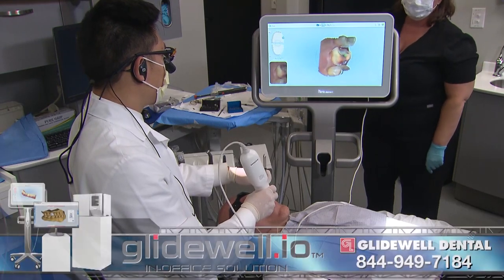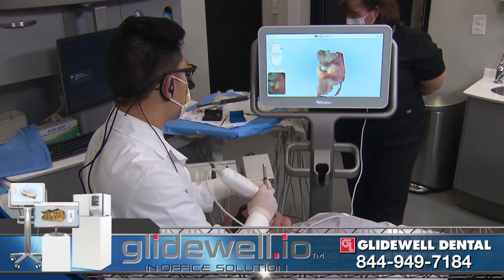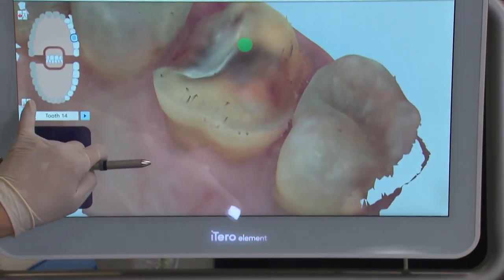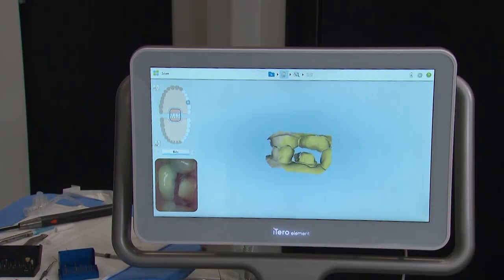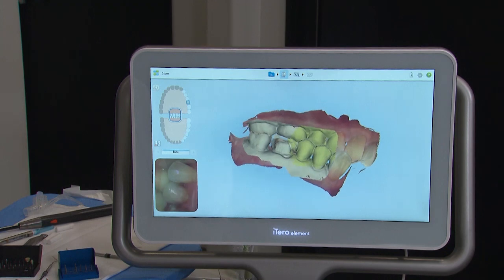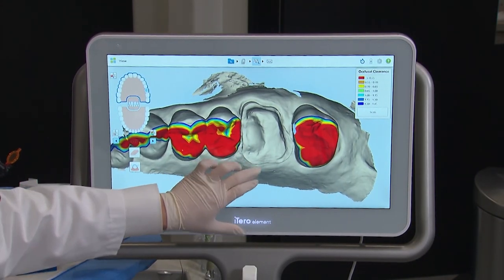I wet the cords and remove them gently to reduce the likelihood of any bleeding. Once I verify that I've achieved the appropriate amount of retraction, I dry the area well, then begin the digital impression using the iTero Element. Once the digital impression is captured of the prep, opposing arch, and bite, the data is transferred to the lab of my choice — in this case, sent to my Glidewell in-office design station.